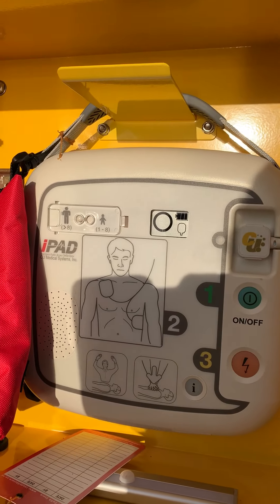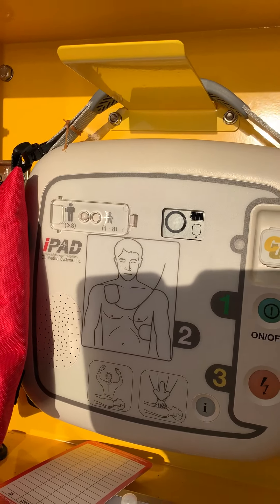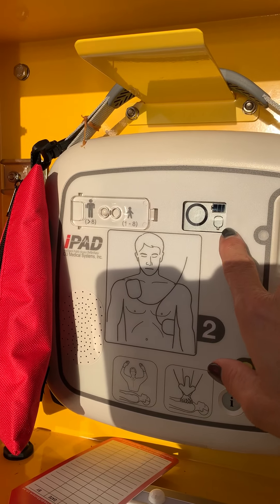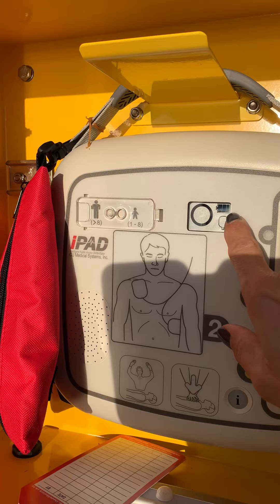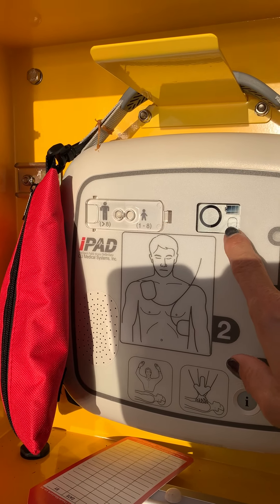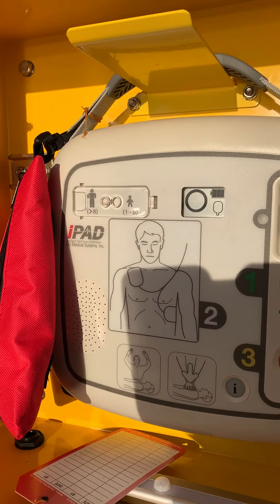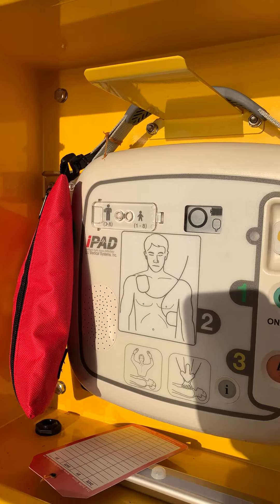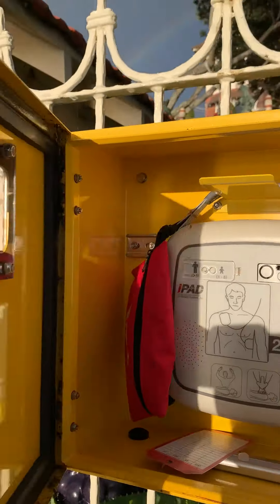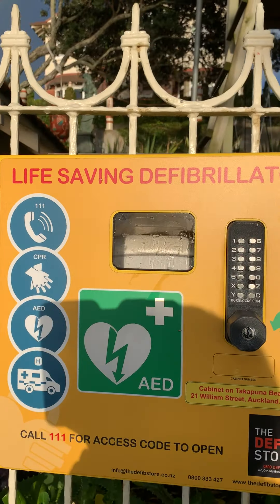This circle here means that it's ready for use — full battery power on this one. The pad indicator shows the pad has expired, so that's what I'm here to do today: change out the pads and bring this defib back ready for use. It's pretty much as good as the day we installed it, and that's three years in.